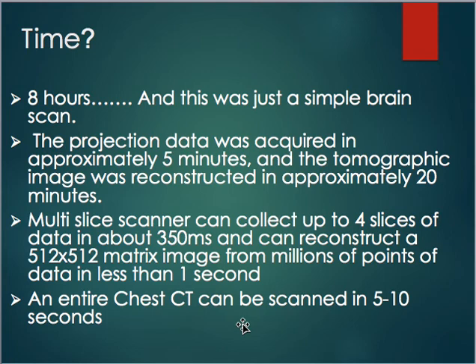In the early days, like I said, it was not good for trauma due to how long it would take. But today, we use CT as a valuable tool for strokes and trauma, which require very fast diagnosis so we can know what's going on and start to determine the route of treatment for these patients.